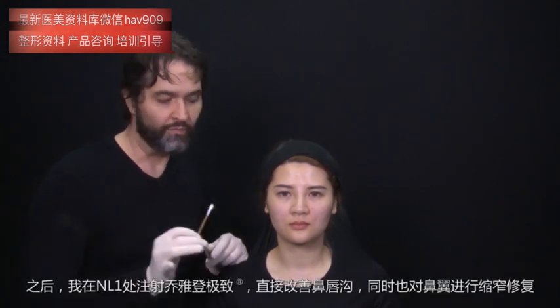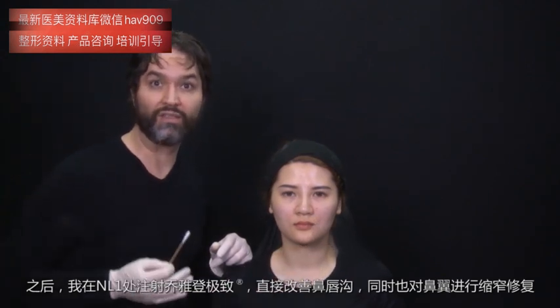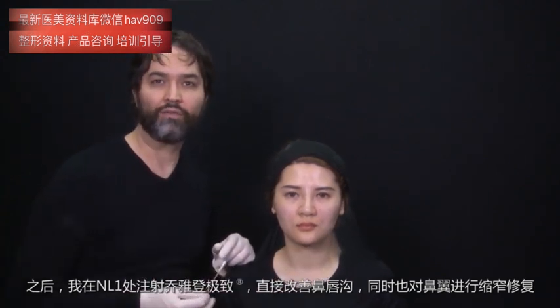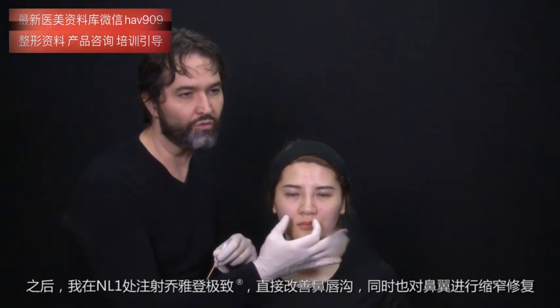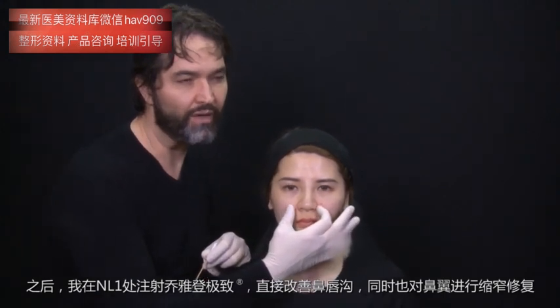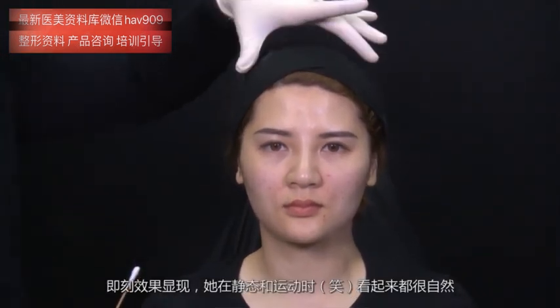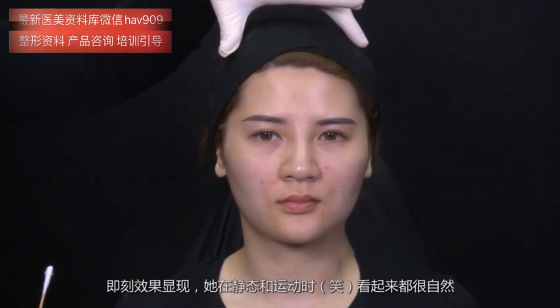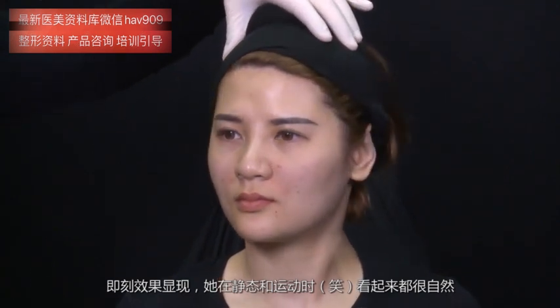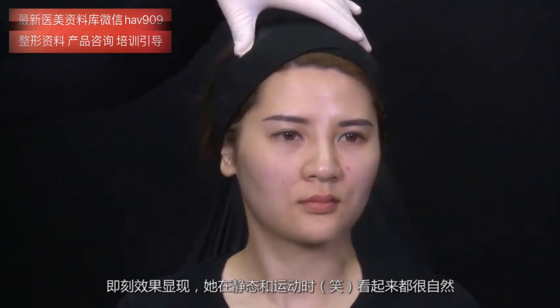And after, to improve the nasolabial fold directly, I have injected NL1 with Juvederm Ultra Plus, and also to give narrowing of her nasal flare. Immediately after the result, she looks natural, both at rest and also on animation. Smile.